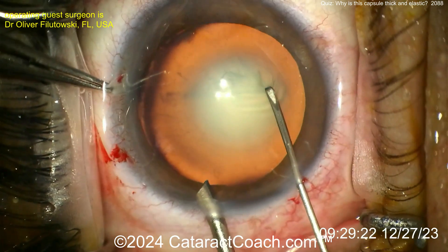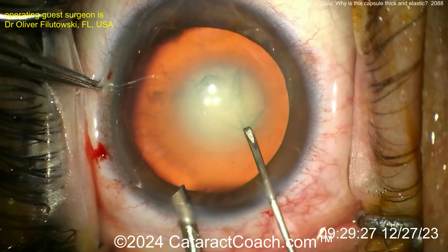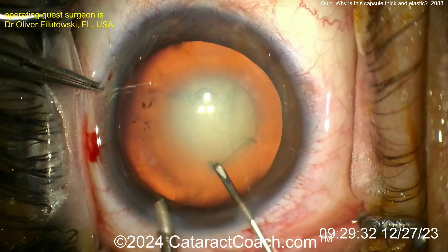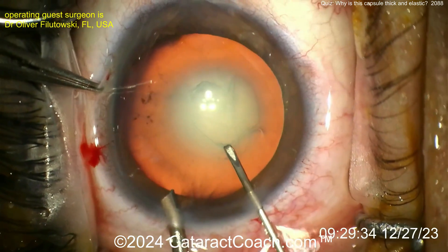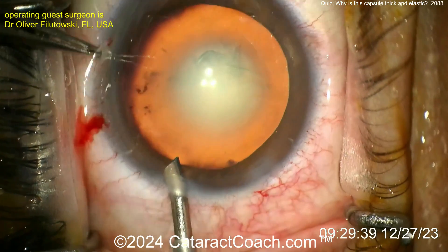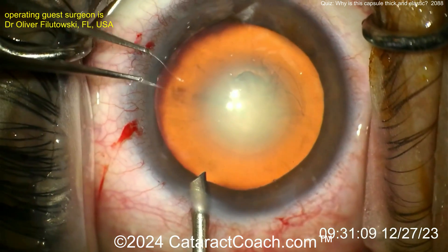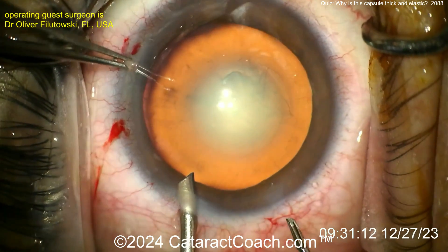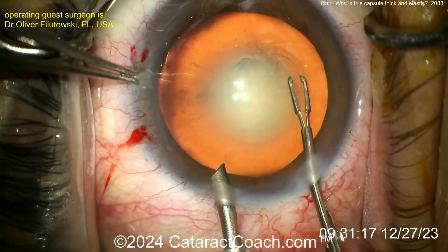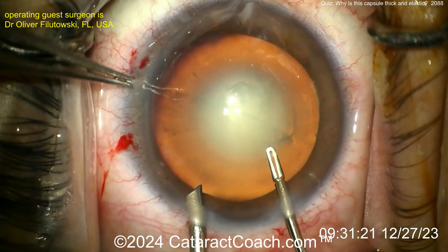You can see this movement of the whole lens capsule — the wrinkling there — and the lens capsule appears really thick, very thick, and doesn't behave normally. Things will be thrown off a bit by that AC maintainer. Instead of using viscoelastic, an AC maintainer is being used, which causes the capsule to flop around a little. Now switching over to micro-capsulorhexis forceps, fixing the eye. Watch the motion as the rhexis is torn — it just doesn't want to tear; it seems so thick.